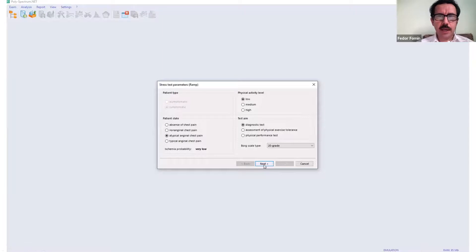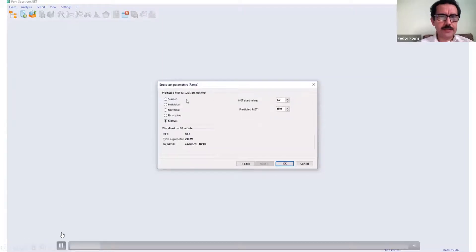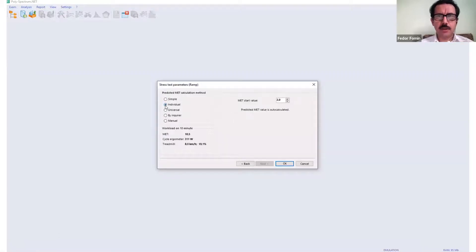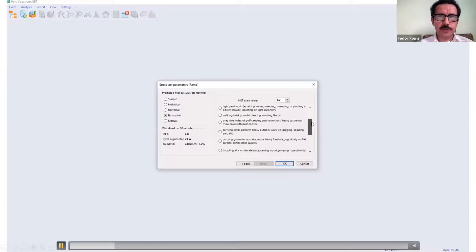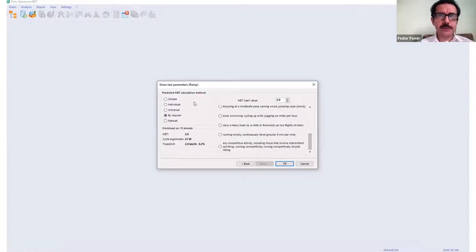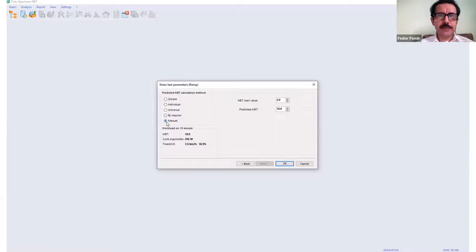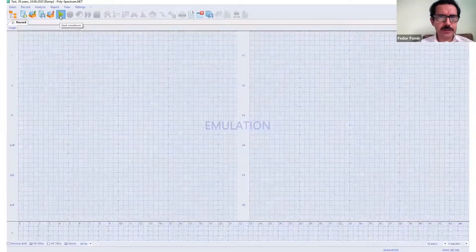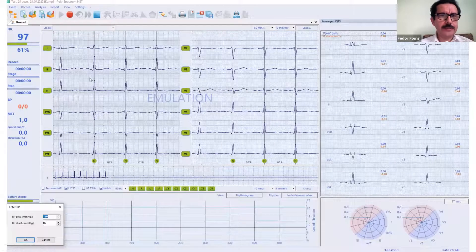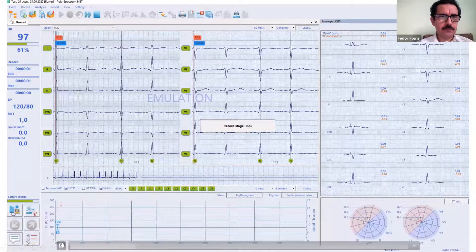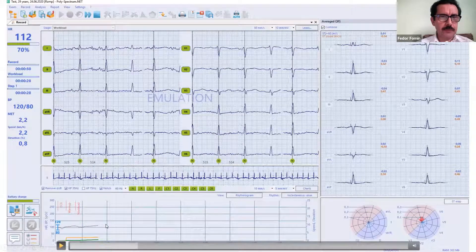Then I proceed to the next step. As I select the ramp protocol, I have different options for how this ramp protocol will be set up, including some automatic selections. I can set up maximum workload according to the person's habitual exercises or just set it up manually. I prefer manual. Then the recording starts.